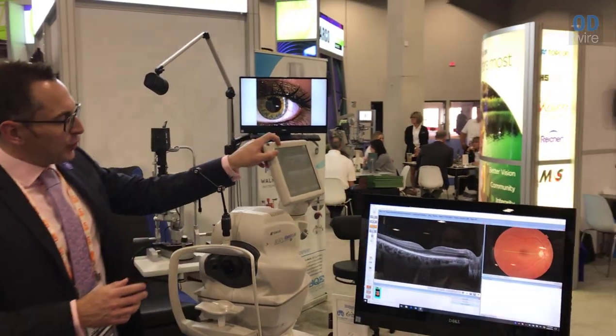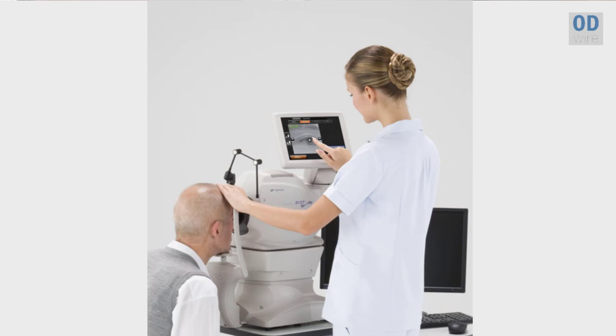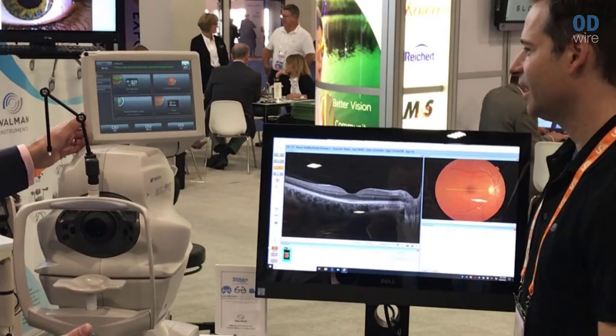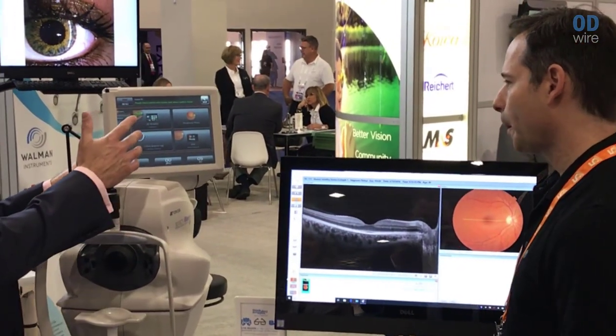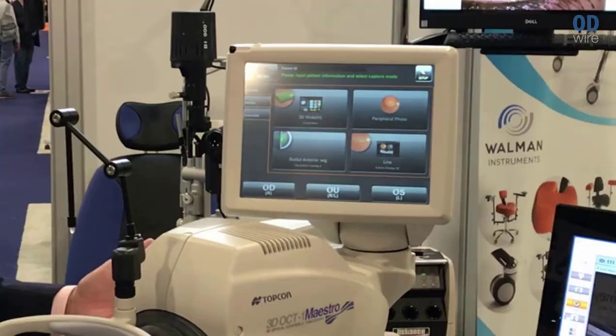If you drive it from behind the patient, you have about a two-foot square footprint, depending on the size of your patient. From an operational point of view, you just tap the screen and the machine will automatically align on the right eye, and then once it's captured that right eye, it will automatically move over to the left eye. Training really is a two-step process: press the button and make sure the patient conforms.